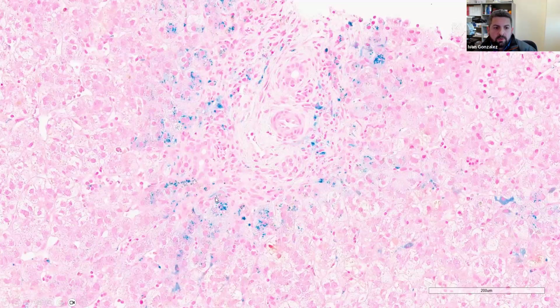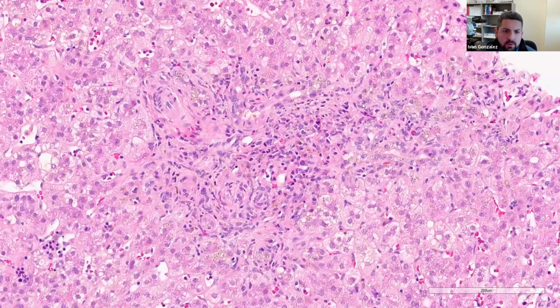Unfortunately, in this photo, I took a photo with an actual bile plug at the same plane, so you can compare the two color differences. If you look here, this one is more yellow, golden, more like bile cholestasis. In contrast, the iron will look more refractile and black, more dark.